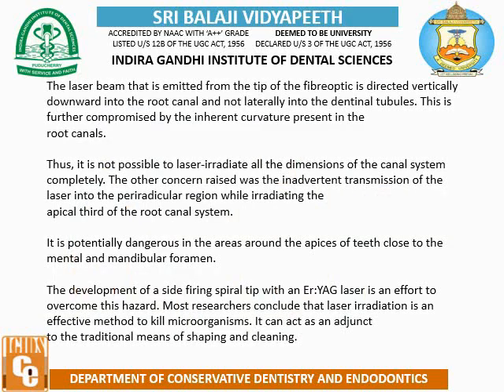The laser beam that is emitted from the tip of the fiber optic is directed vertically downwards into the root canal and not laterally into the dentinal tubules. This is further compromised by the inherent curvature present in the root canals. Thus, it is not possible to laser irradiate all the dimensions of the canal system completely.